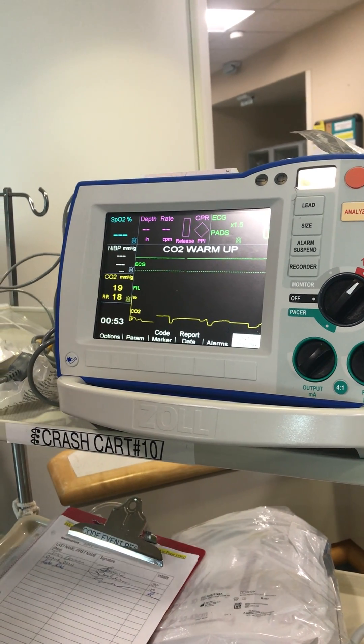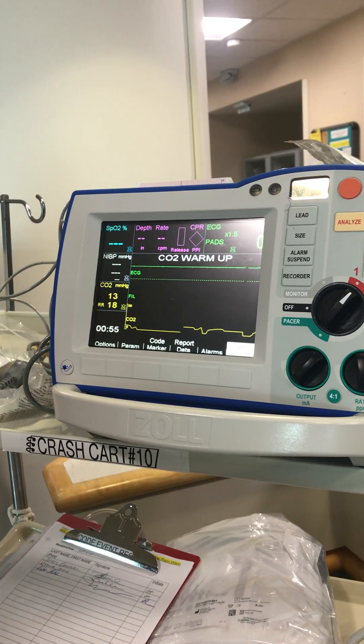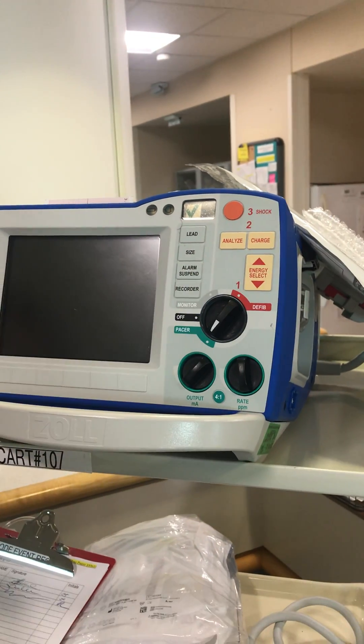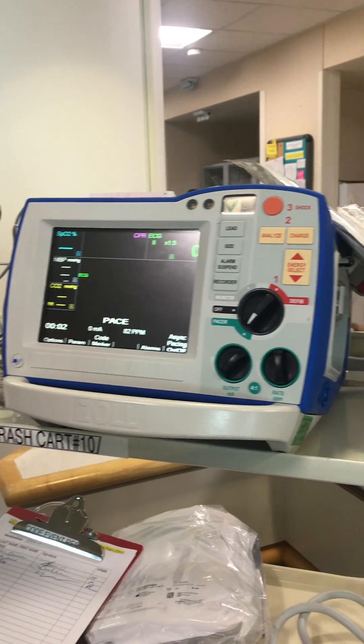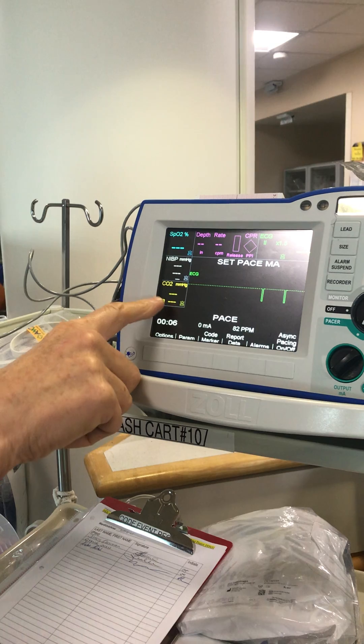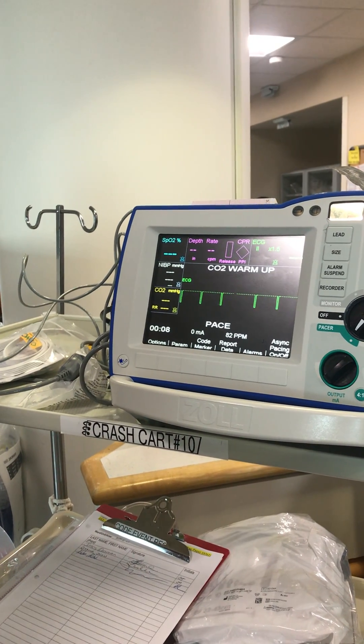You want to use this to guide your chest compressions during CPR. When you're in the monitor mode or in the pacer mode, it's got to warm up for a few seconds, and it'll display your value right here, but it won't give you the waveforms.